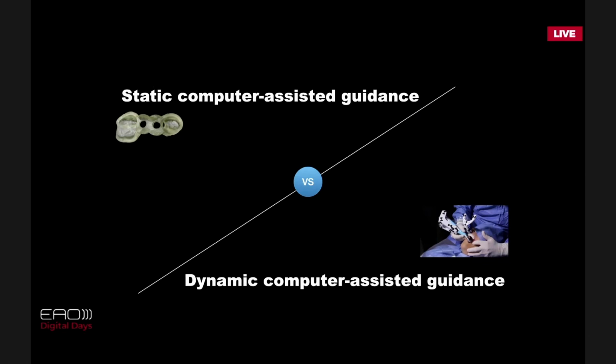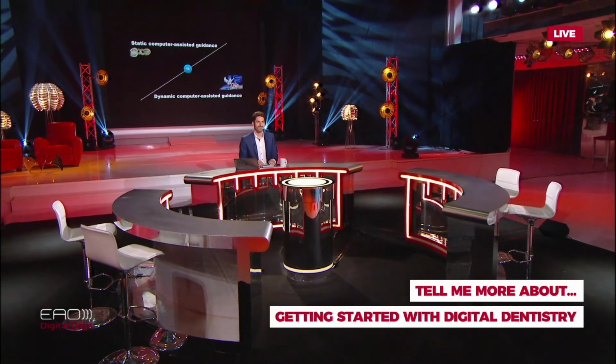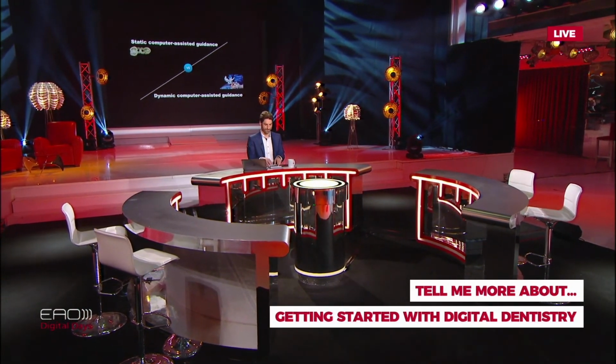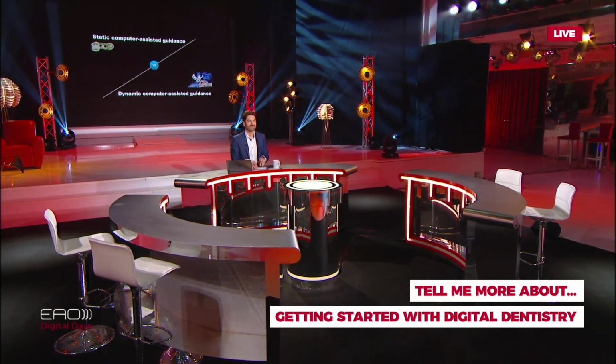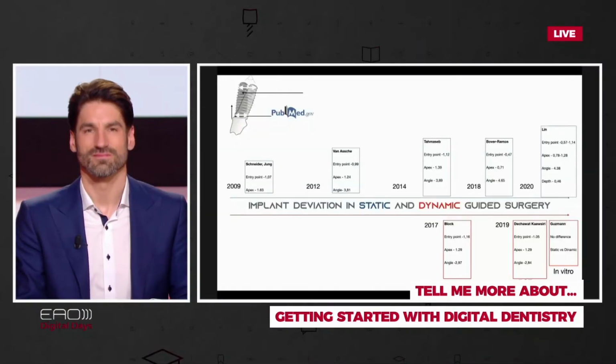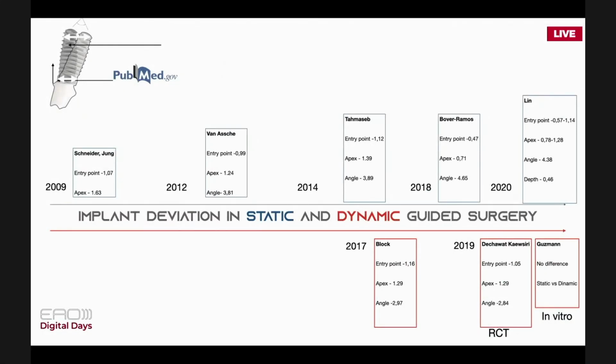And the last piece is that we saw, and you had here Dr. Block that talked about this. If you compare the static computer-assisted guidance with the dynamic assisted guidance, one would expect that, because you have now robotics in the way, it would increase the outcomes. And in fact, when you compare both in the systematic reviews or in the randomized clinical controlled trials, from the implant deviation of static, there in the above column, to the dynamic guided surgery, you see that even the dynamic guided surgery in the latest reports has some sort of deviation.